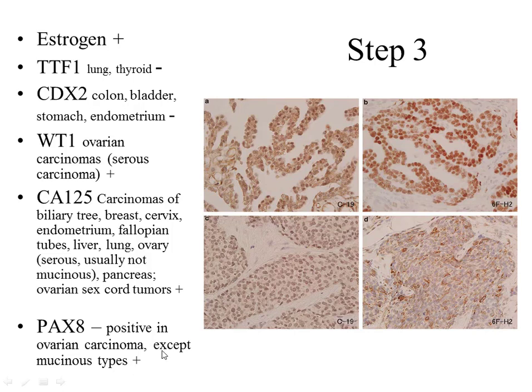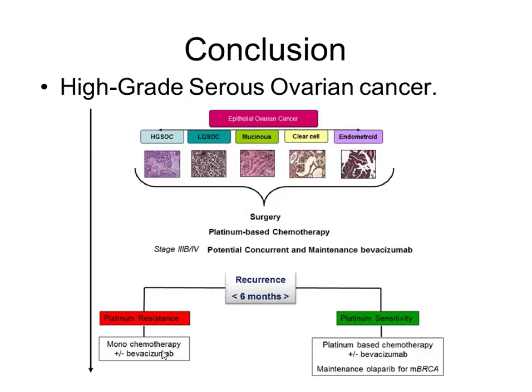So our diagnosis according to the immunohistochemical reaction was high-grade serous ovarian cancer with a metastasis to the omentum, sitting in the abdominal cavity. It's of course a deep stage of the cancer. It's very difficult to treat a patient in this period, but of course chemotherapy is possible.